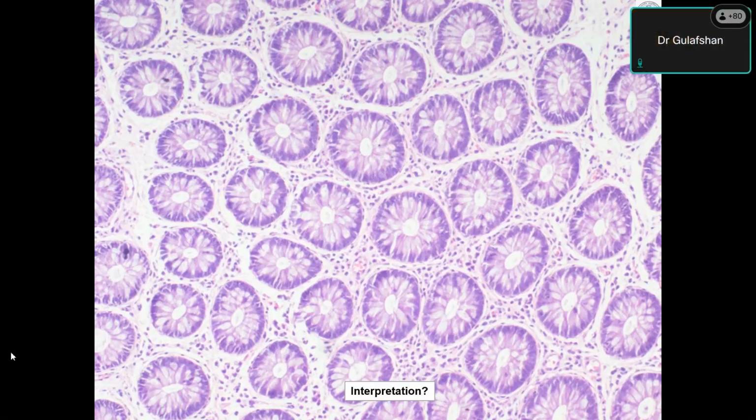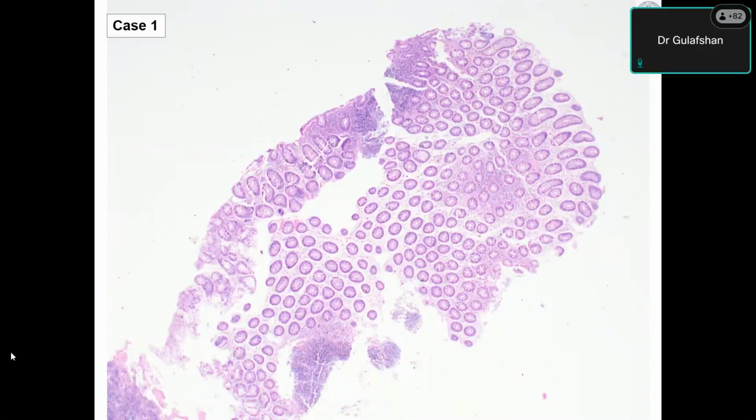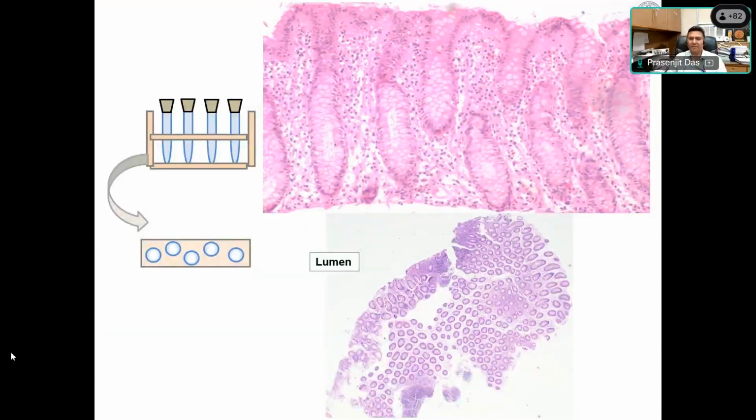When the distance increases, it shows edema or some neutrophils. Inflammatory cells will show more and more. Okay, that was very nice. There are only a few inflammatory cells present, but if they are present in deeper parts, it will be some other defect. Okay, so let us see how we interpret.